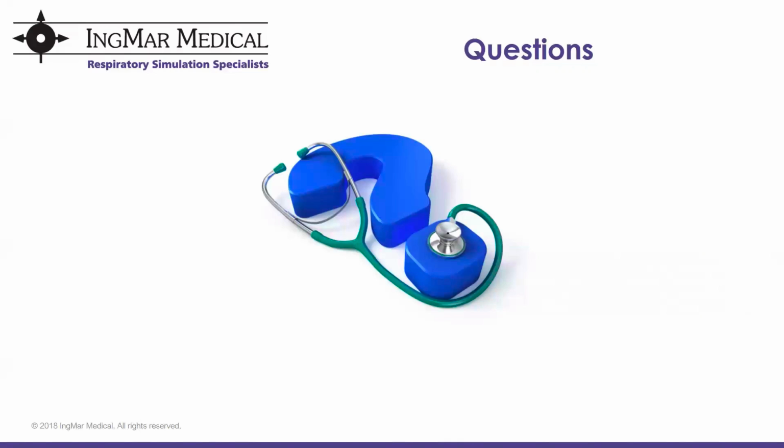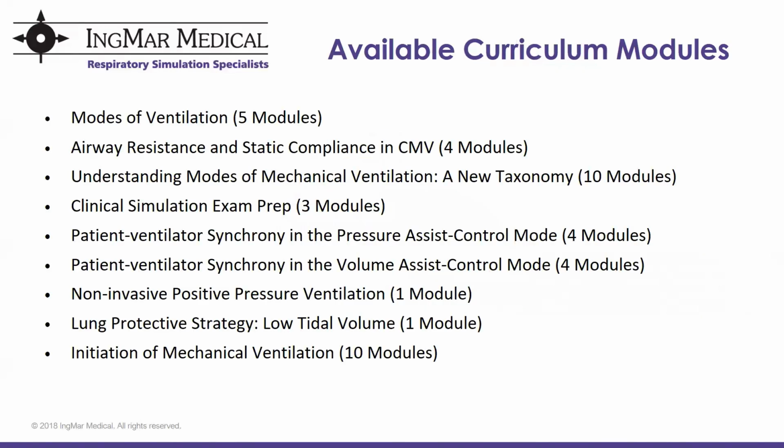I can back up to that slide. So we use those types of respiratory conditions that are breath patterns, essentially, and we use those as a foundation for creating scenarios on the topics that you see here.